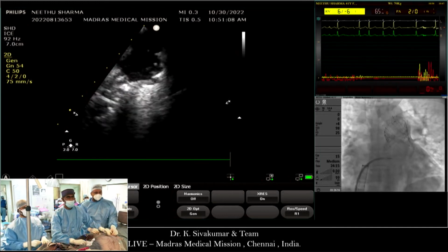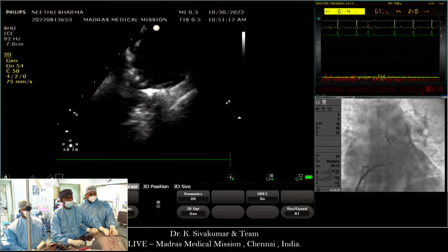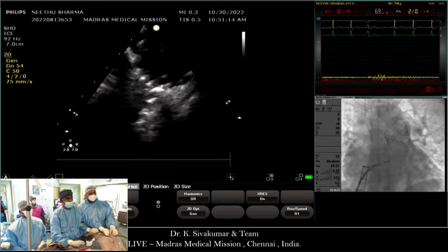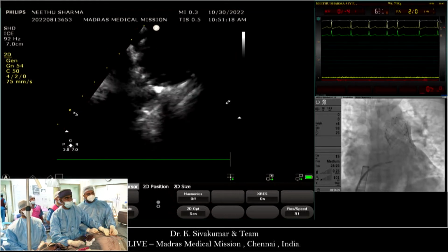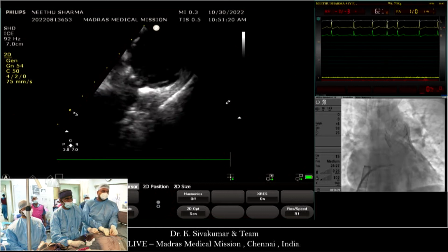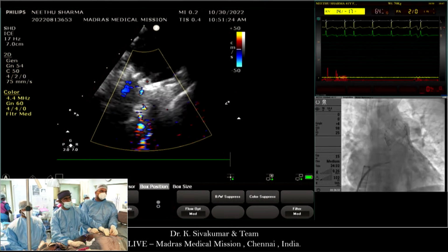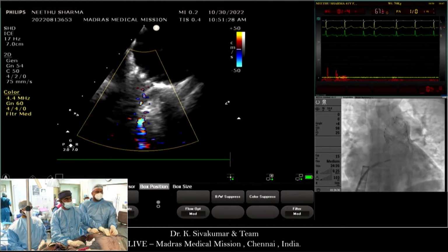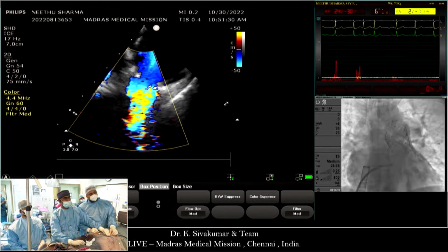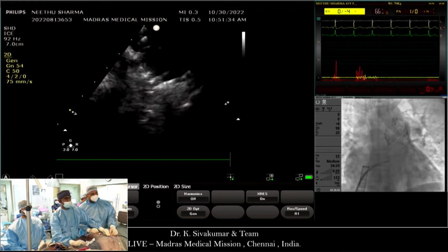Shiva, are you trying to figure out paravalvar leak with the ice catheter? Not the valvar. Okay, now we will see whether there is paravalvar also. Okay, run it by echo color. What's the structure moving there? Yeah, I'm also seeing what it is. I'm not finding a significant regurgitation. Take the color out, Alka. Can you disconnect the power cord there? Whether electrical artifacts.